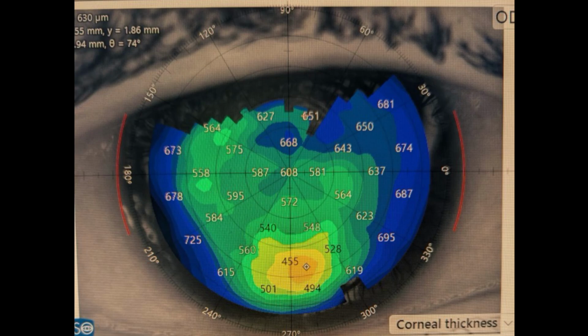You will always want to get away with doing a DALK if possible rather than a PK, especially if the patient is phakic, because the incidence of cataract formation after DALK is less and it occurs more slowly than after PK. PK also has greater complications associated with IOP rise and a greater need for steroids, especially in high-risk cases and especially in herpetic disease.